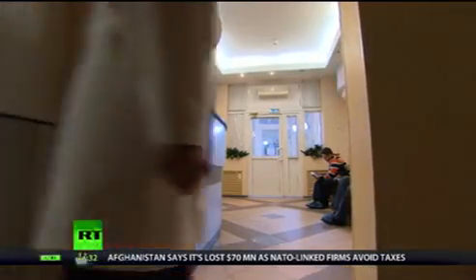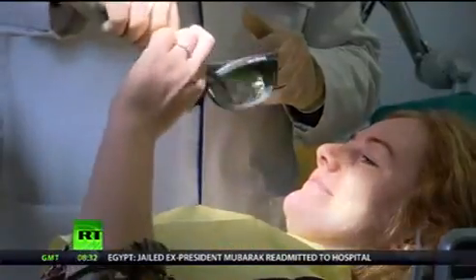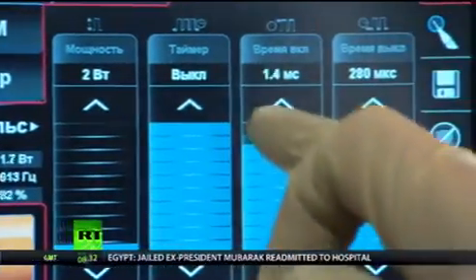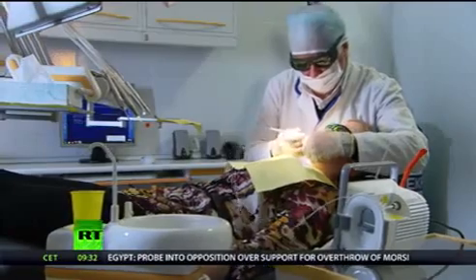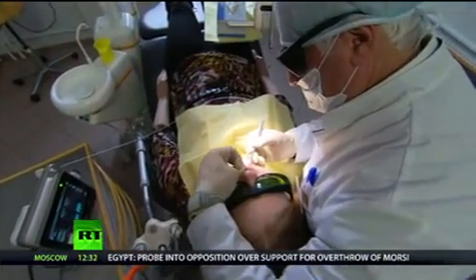For many people, there's nothing more stressful than a visit to the old tooth doctor. But many are turning to new technology to soothe their patients' nerves. For more invasive surgeries, more and more dentists are now using laser scalpels to make the necessary cuts. These are often perfect for surgery in the mouth because as it slices, the laser cauterizes instantaneously.